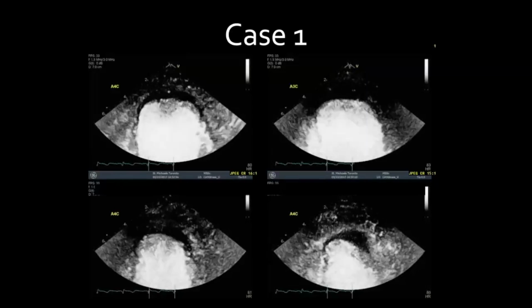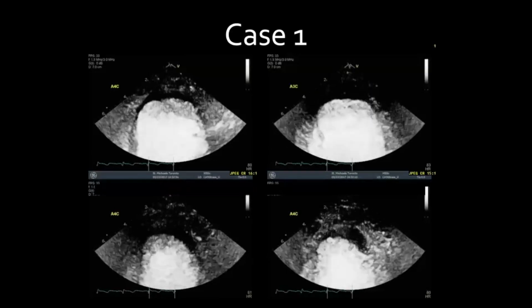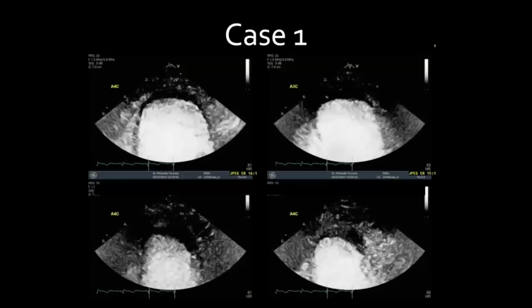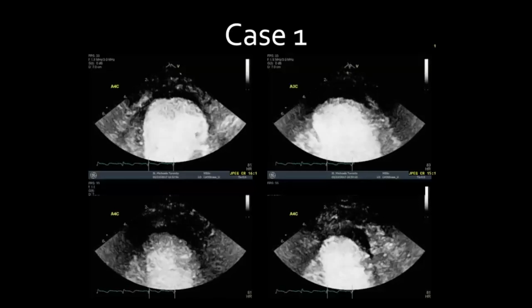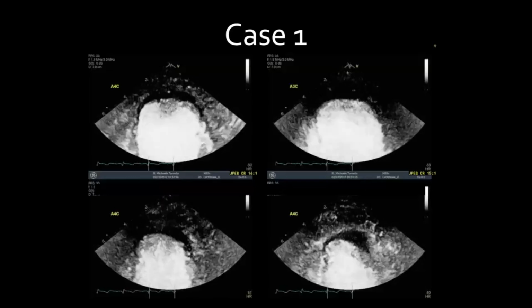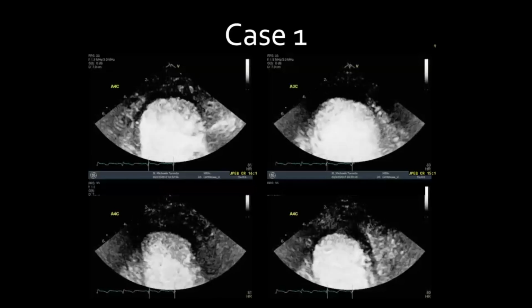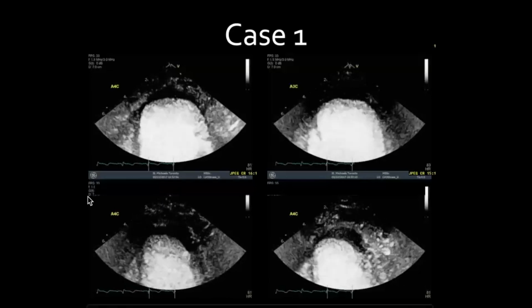With that, you're allowed to give more ultrasound enhancing agent to fully opacify that LV apex. If there's an aneurysm, we know there's stasis of blood at the apex, and sometimes the apical aneurysm is difficult to fill with the agent, so you get all that swirling that you see. If you see that, you have to give more agent. You also always have to give enough contrast to cause attenuation at the base, but with the zoom views, you don't care about the base; you want to focus at the apex. And as Grace mentioned, you can see there's a laminated apical thrombus.